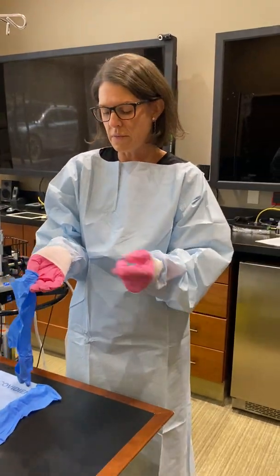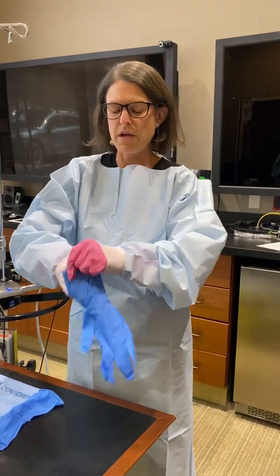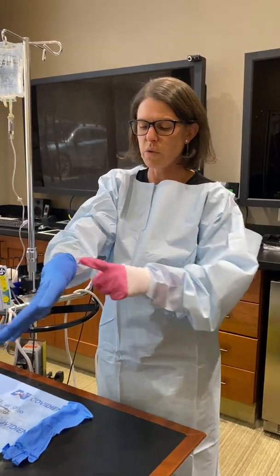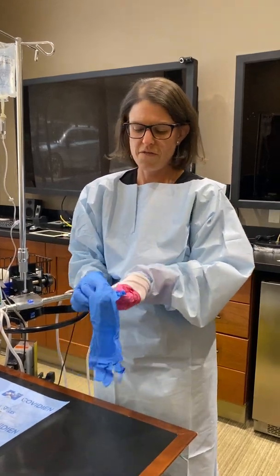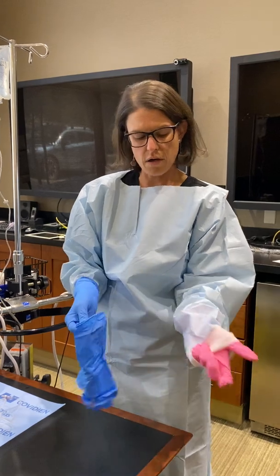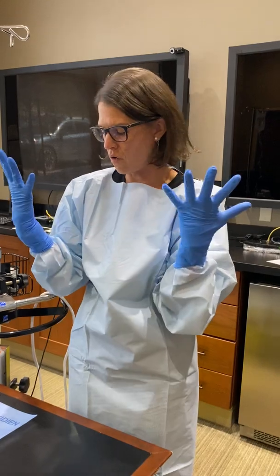You'll always want to make sure to cover the fabric of the gown with the second pair of gloves, so if there were to be a chemo spill you wouldn't get chemotherapy through that fabric onto your skin. If you keep the cuff down by your fingers and hold it with your other fingers while you put this one on, that holds it pretty well to get it on over.